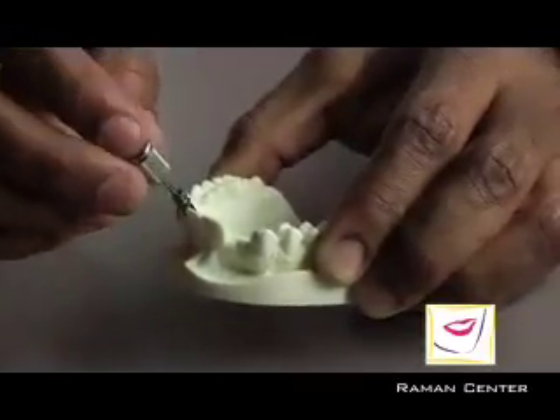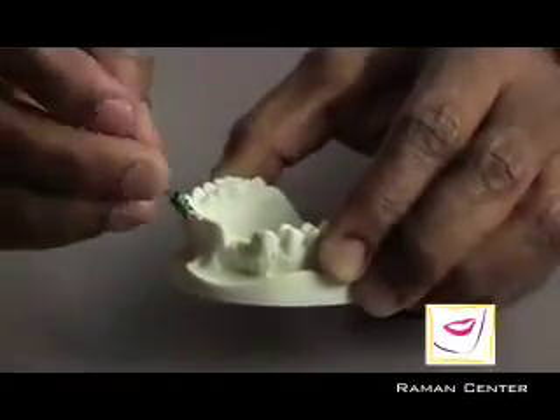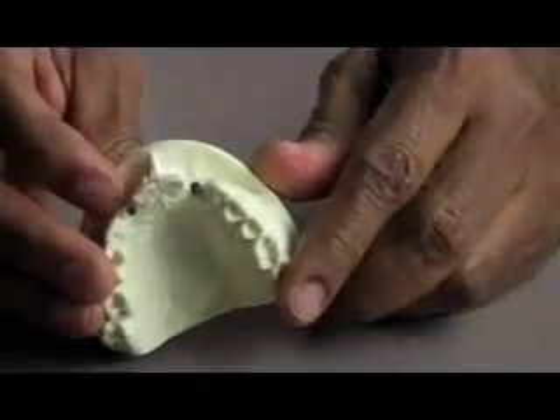The guide part — the green part — is removed, leaving the implant placed in exactly the proper angulation, exactly the proper depth. This is what it looks like inside.